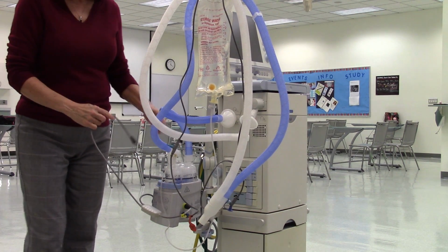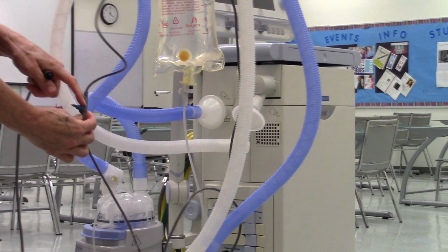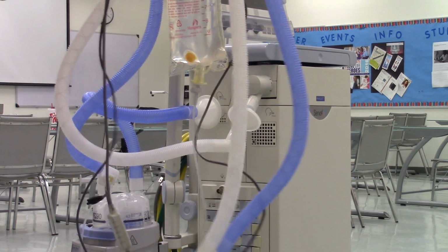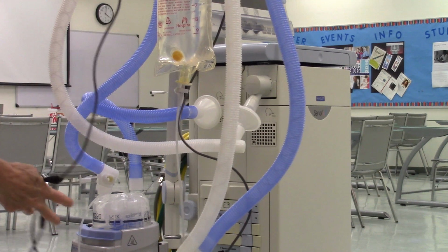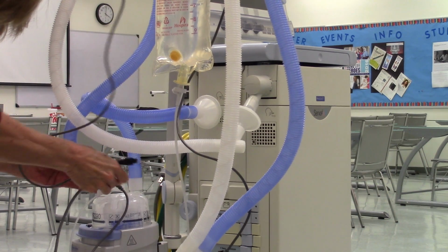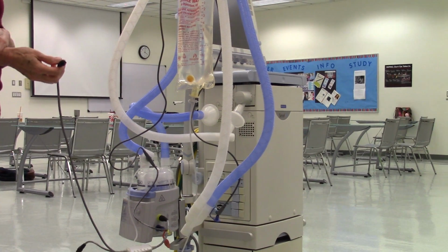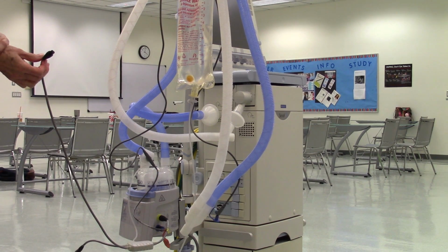Is that a good spot for you to see it? Yep. Okay. And then the sensor that goes in there, it has a shape to it, and you kind of match up the shapes like you're putting a puzzle together. All right, so it has a triangle, and I'll match it up with this triangle when I put it in. Okay. What else does it say? And then it says, it sends information back to the humidifier about the temperature and flow at the point in the circuit. And that's where it ends.